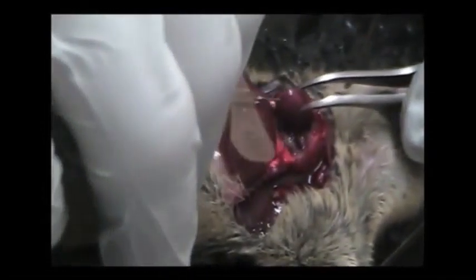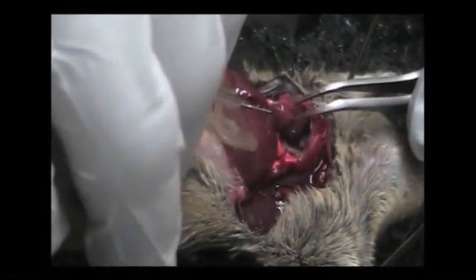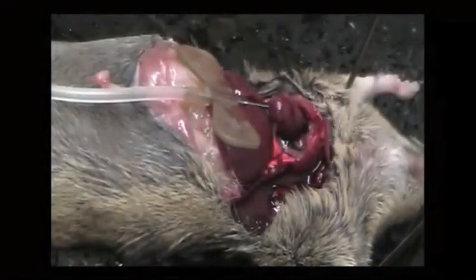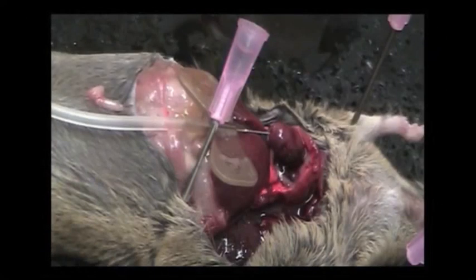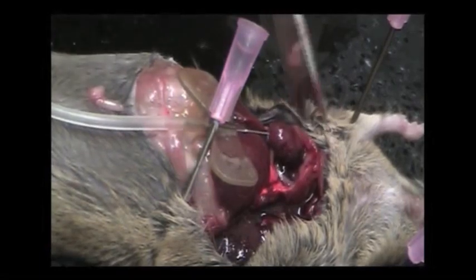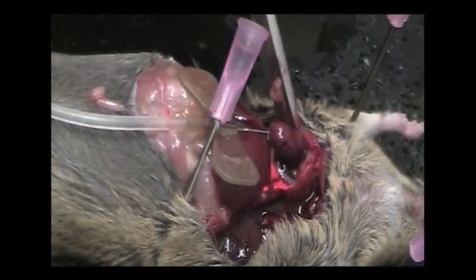and what I'm doing is I am plugging the needle into the left ventricle in this case. The connection between the atrium and the periphery of the animal I'm going to sever right now.